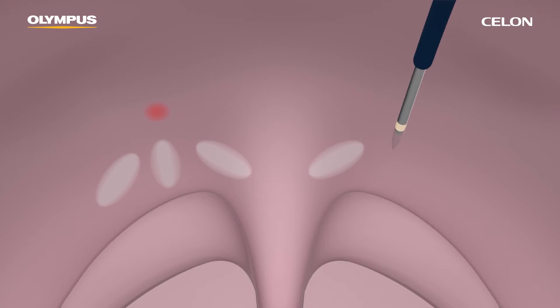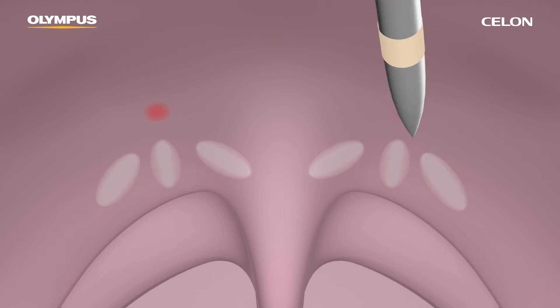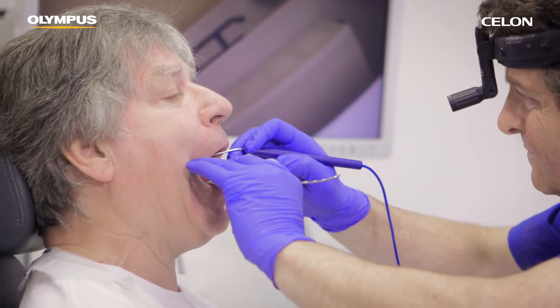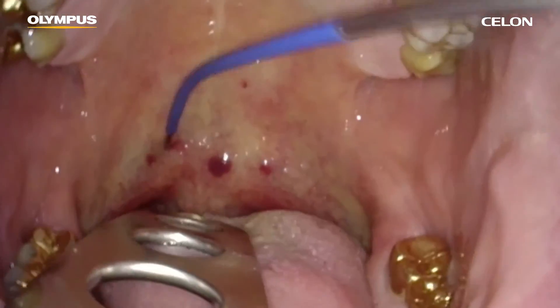Make sure that the tip of the applicator is located as precisely as possible in the middle of the tissue. To avoid mucosa damage, don't place the coagulations too laterally or inferiorly. Also, to prevent unnecessary swelling, do not insert the needle tip up into the uvula.